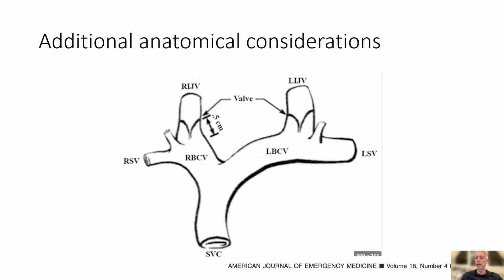One author suggested adjusting the bed until the taper is in the middle third of the neck to be sure. So, if the height of the JVP appears to be at the level of the clavicle when the patient is at 60 degrees, lower the head of the bed to see if you can relocate the IJ to the middle third of the neck. If the maximal collapse does not shift, the location of the JVP at 60 degrees was likely artifact.